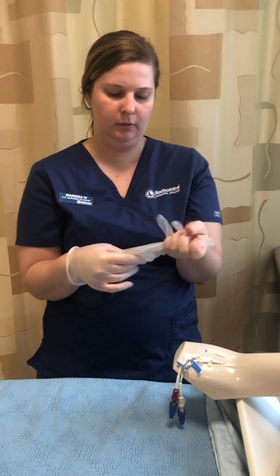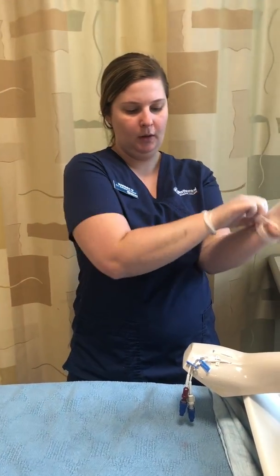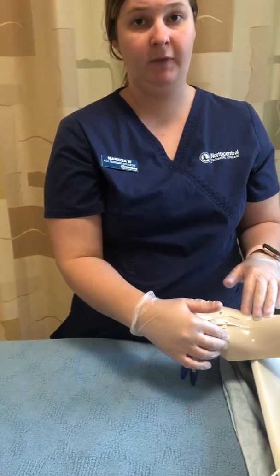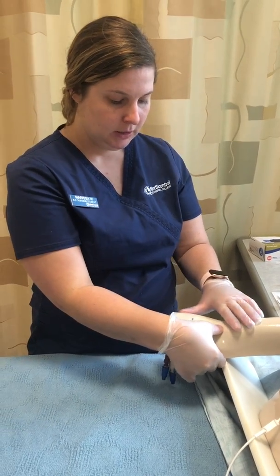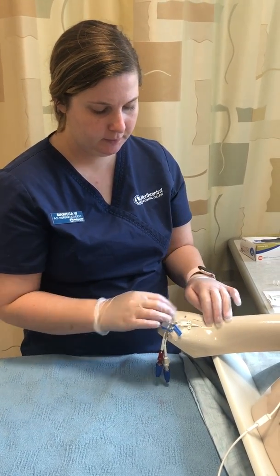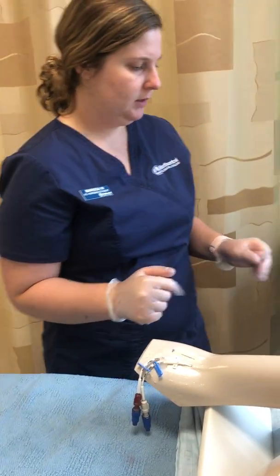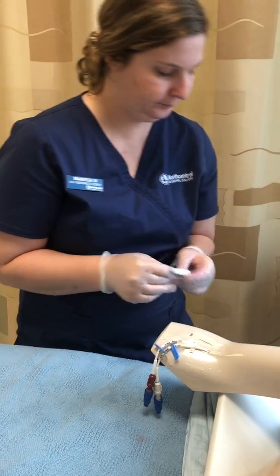And then when I put my gloves on, I'm going to assess my arm right away. When I'm assessing my arm, I'm assessing for infection, infiltration, and dislodgement of the PICC line. So I'm going to go ahead and just palpate around, and everything looks good. There seems to be no signs of that. So I'm okay.